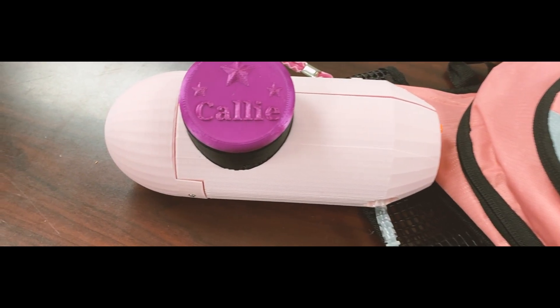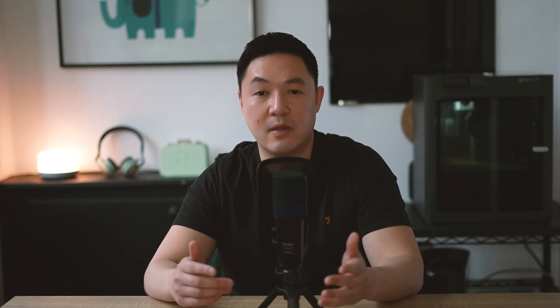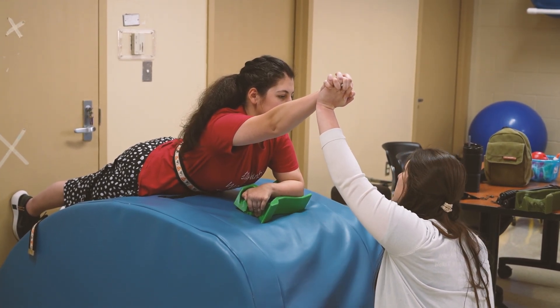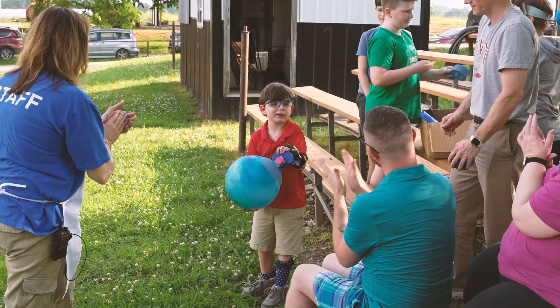Make it personal. Personalisation can make an assistive device go from useful to truly meaningful, and it can come in many different forms. Aesthetic personalisation might include names, colours, or favourite characters. Functional personalisation, on the other hand, could mean designing a perfect-fit device tailored to someone's specific physical needs, or adjusting features to match their daily routines. Whether it's about style, fit, or function, personal touches show thought and care, turning a product into something that truly feels like it belongs to the person using it.